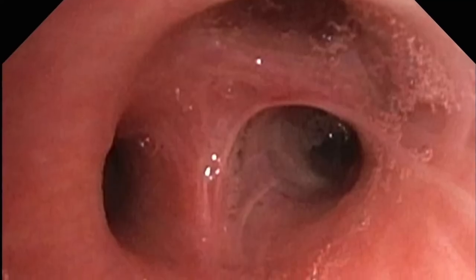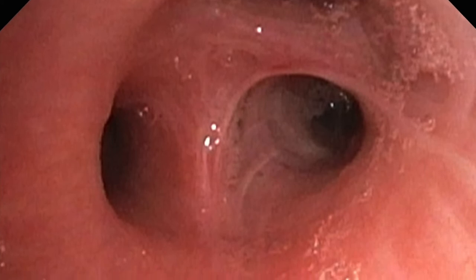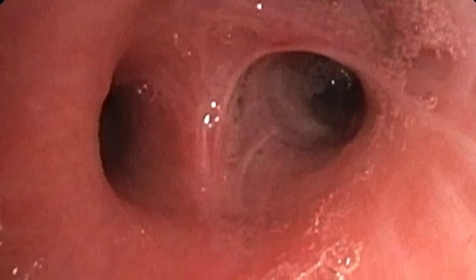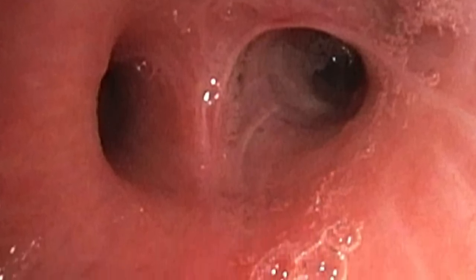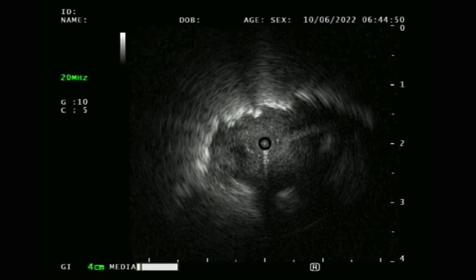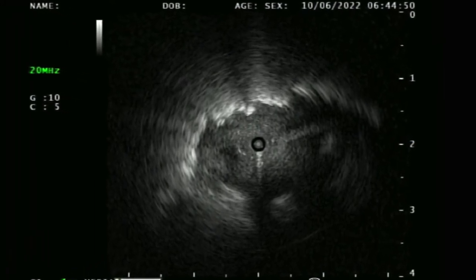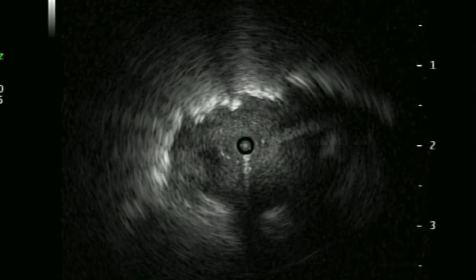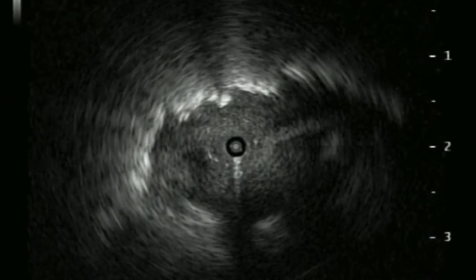I proceeded to bronchoscopy and at bronchoscopy the endobronchial appearance was very normal. You can see an image of the right upper lobe showing that it is normal — there is no endobronchial lesion and no abnormal secretions to suggest infection. The airway mucosa may have been slightly inflamed. I used the radial EBUS and was able to locate the mass, getting the ultrasound within the wall of the mass, which allowed me to take brushings and biopsies for histopathology and culture.